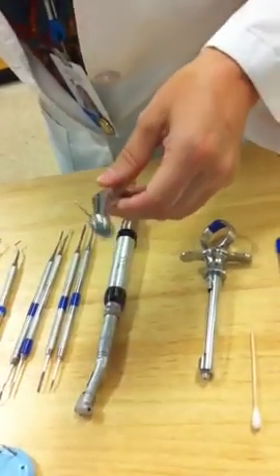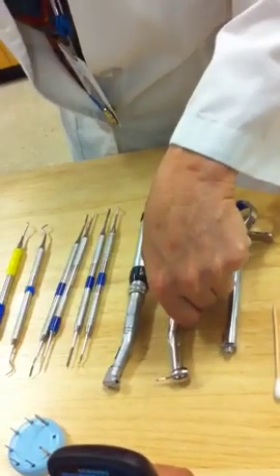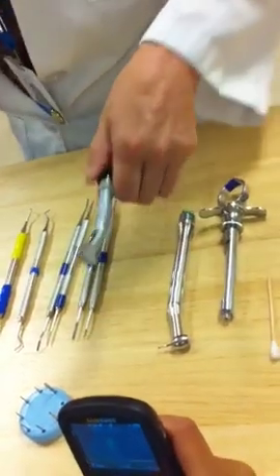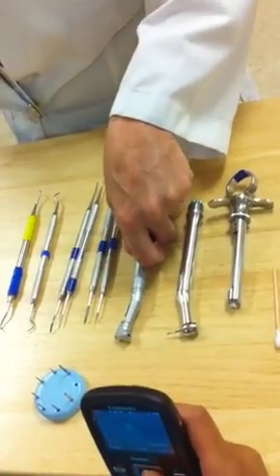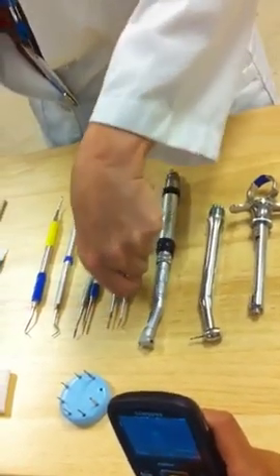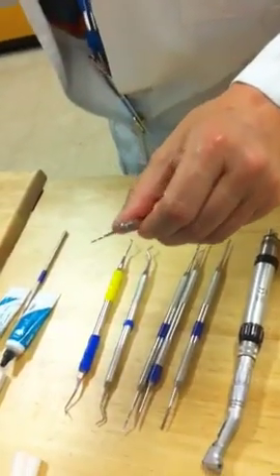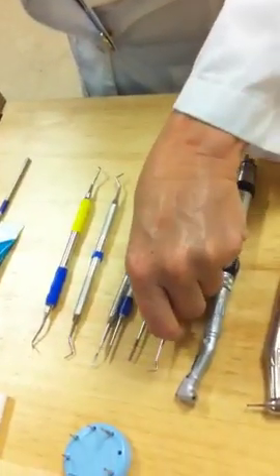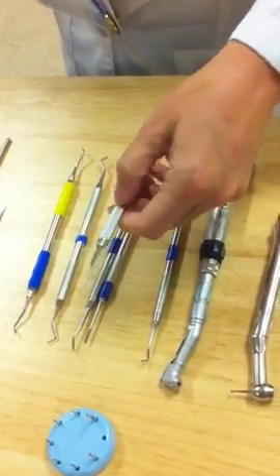Once the patient is numb, you'll be using the high-speed handpiece with doctor's choice of burrs to open the tooth. If you get close to the nerve of the tooth, you're going to be using the slow-speed handpiece with the contra-angle and a latch-type burr to clean the area. Once you're done with that, you're going to use the spoon excavator to remove any decay or debris from the area. Then you're going to go in and use the hand-carving instruments.